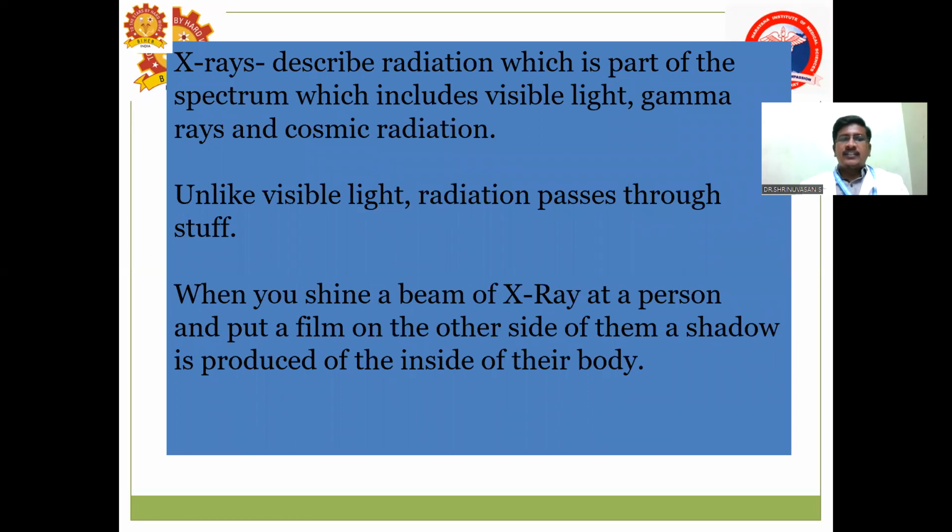Basically, first, what are X-rays? X-rays are part of the electromagnetic spectrum, like visible light, gamma rays and cosmic radiation.